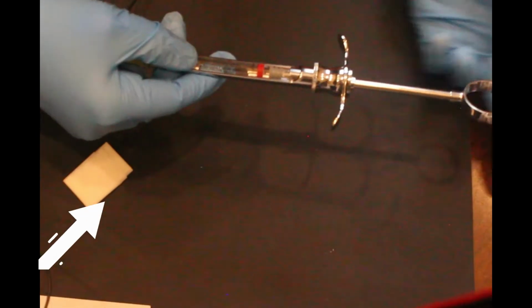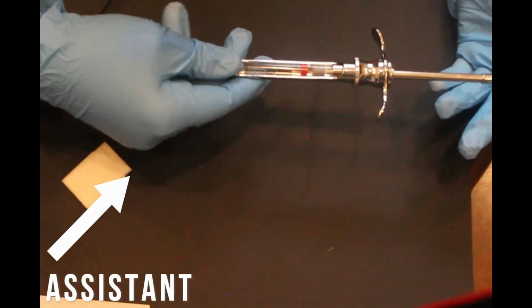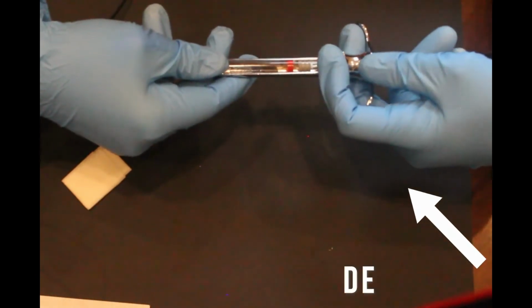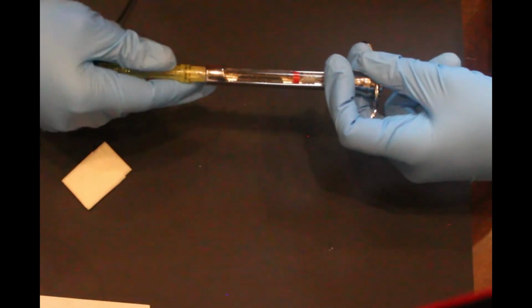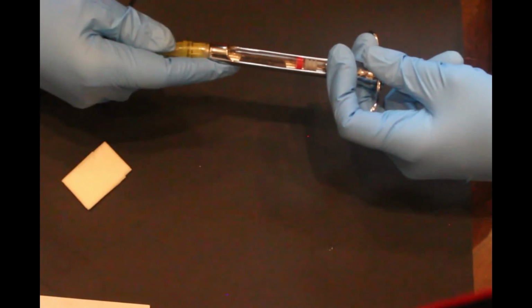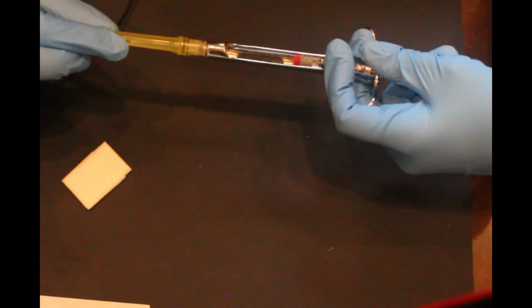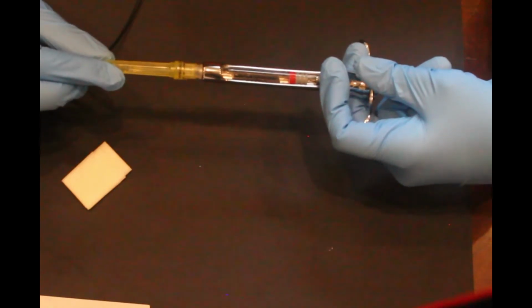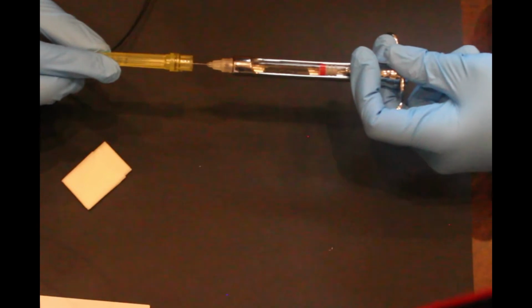In this example, the left hand would be the assistant's hand and they will hold the syringe with needle side facing them. The operator will then grasp the loaded syringe. Once they have a firm grasp, the assistant can loosen the cap a little bit and hold the top part of the needle cap. This is the cue for the operator to simply drag the syringe towards themselves and use it on the patient at this time.